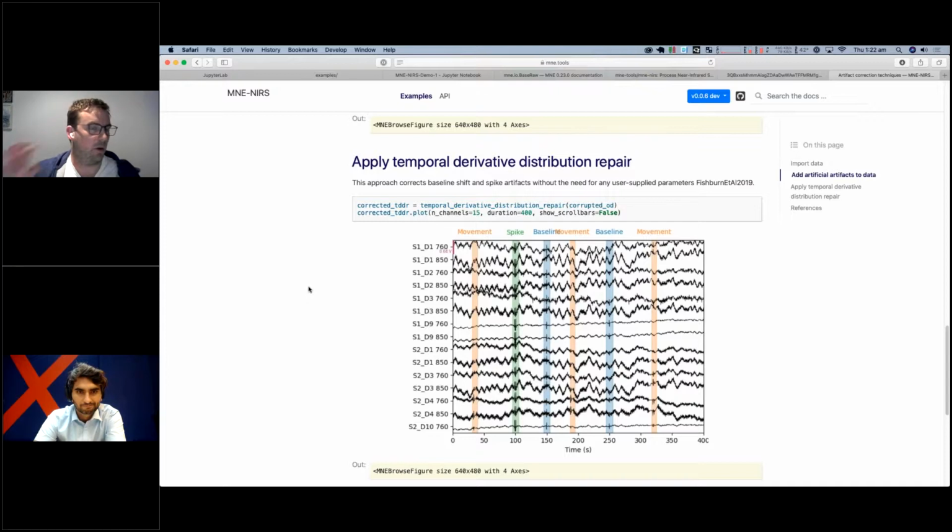Okay, yes. MNE has been around for many years, and I don't run it on my own. There's a group of maintainers, of which I'm one, and every time we submit code, I can't submit code automatically. I have to submit code, and then somebody else reviews it, and it gets checked. So there is a slight time lag between code being submitted and it being available.